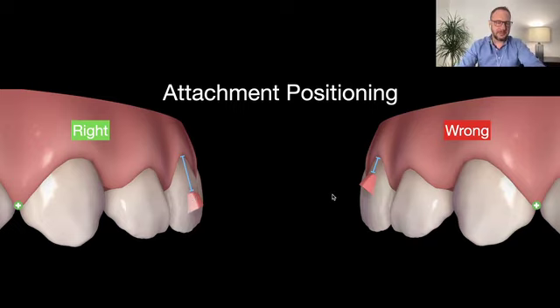Sometimes the patient asks us to be as discreet as possible, and then we want to move the attachment up to avoid showing it, and we have only this distance here. Why is this a problem? Because sometimes this attachment pulls the plastic out, and then we don't have enough force from the plastic between the attachment and the gingival margin to bring it back. This is just a minor amount of plastic here in this area.